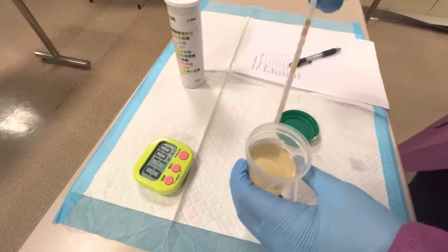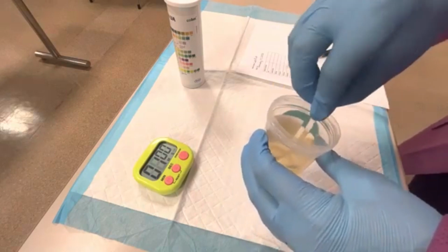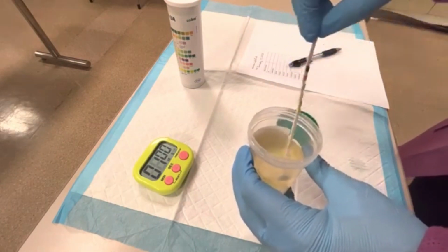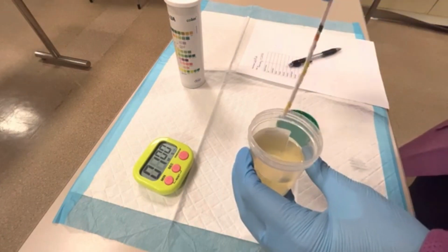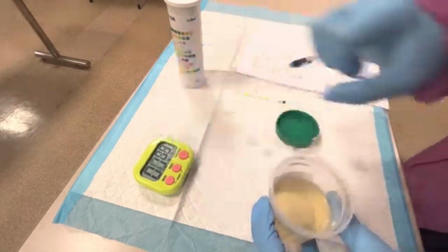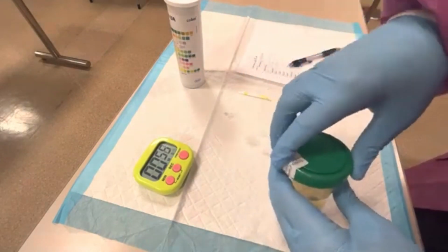All right, so I'm going to take this strip and dip it all the way into the urine, make sure all the pads are saturated with that urine, and then pull it out and put it to the side so that all the urine drips back in, and then tap it to the side and set my timer. All right, and I'm going to close my urine and wait for that 60-second timer.